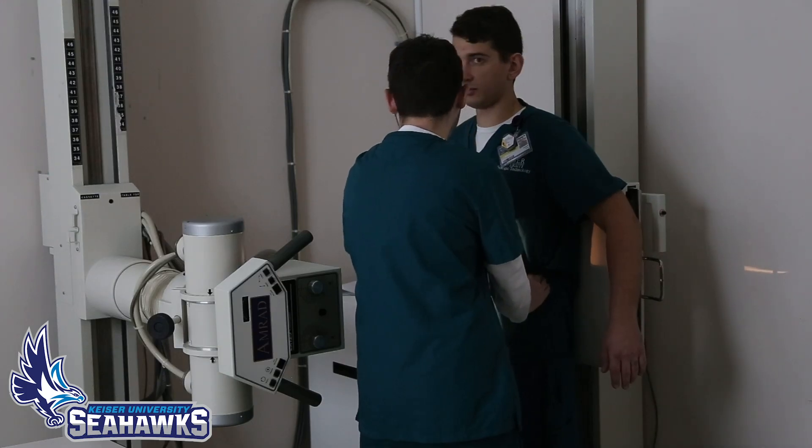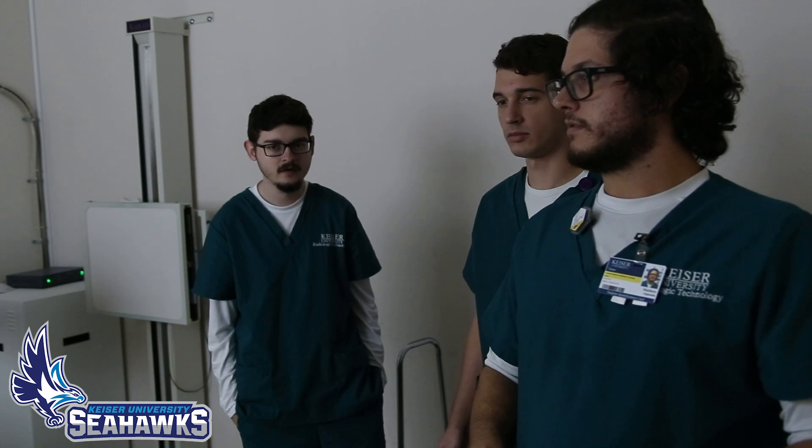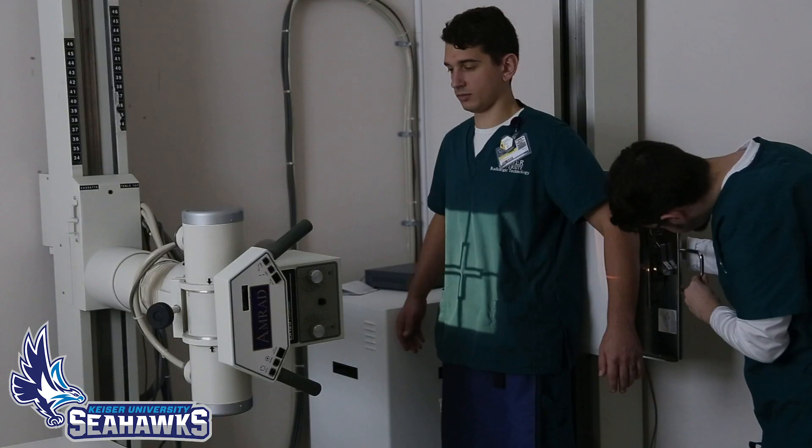Right now we're working on positioning patients so that the x-rays we take come out correctly, so all the anatomy is in the correct position. We're learning that right now.